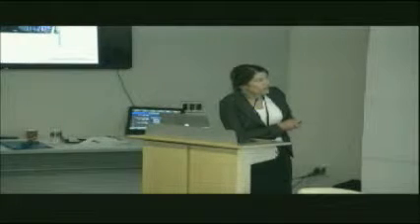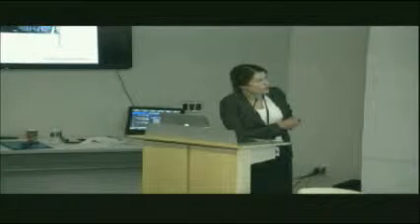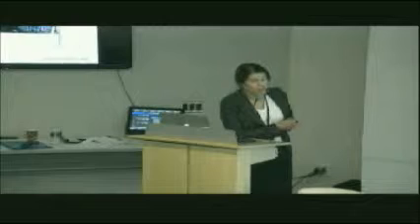And we know that as you go further out from where that coil is, the TMS field, which is demonstrated here, gets smaller. So this is the distance that the signal will travel once you put this stimulator on, and this is how much of an electrical field you'll emit.